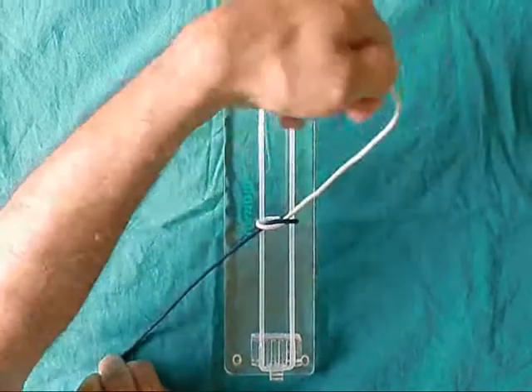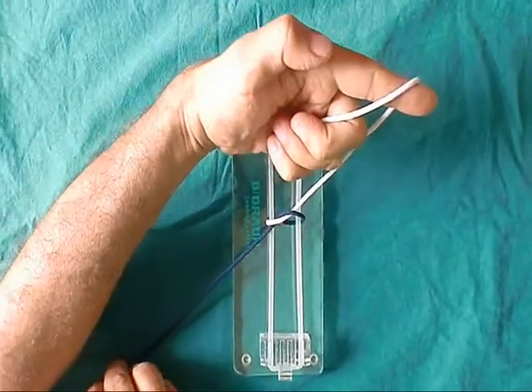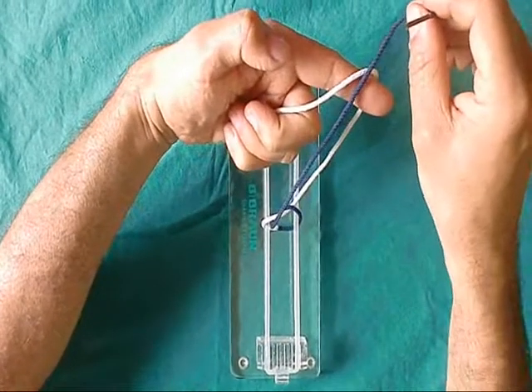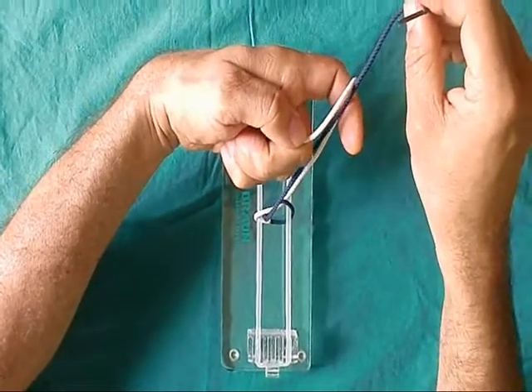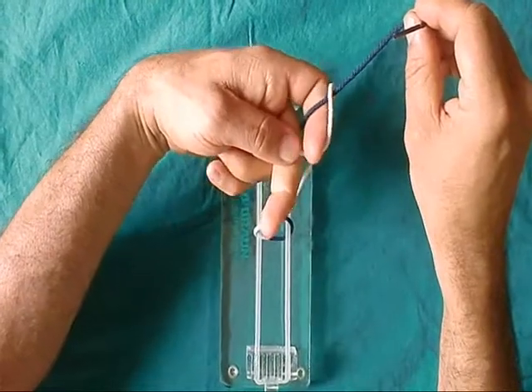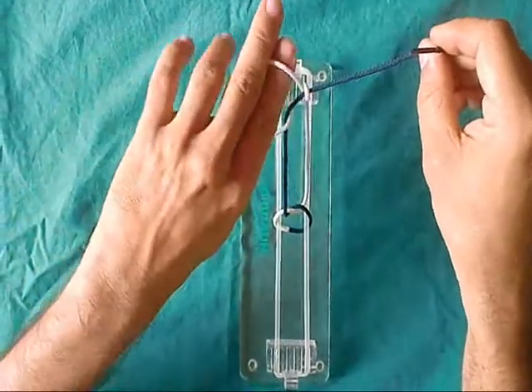Change the grip to a pistol grip of the left hand. Bring the black thread over the index finger. Make a loop of the index finger.